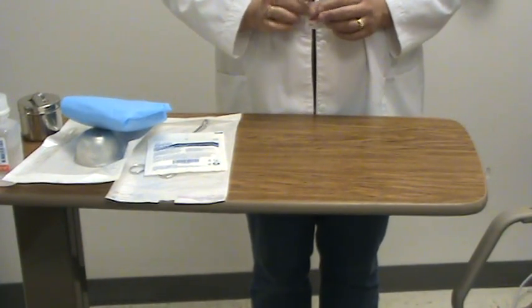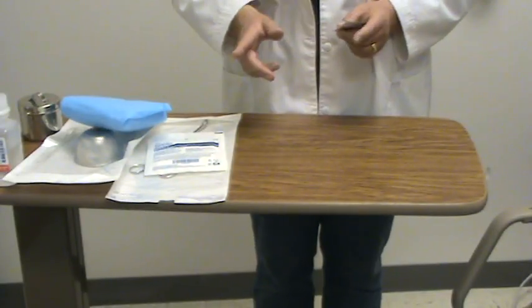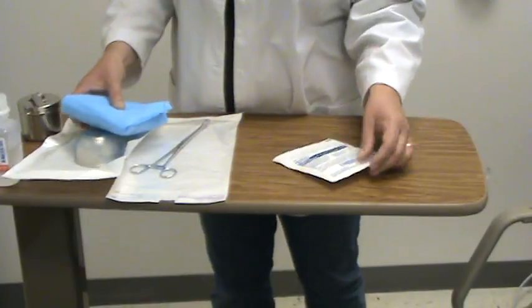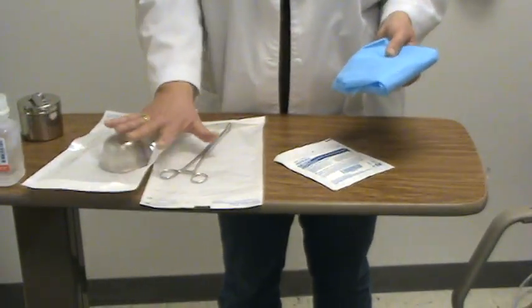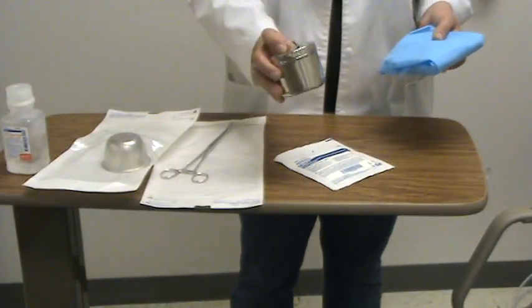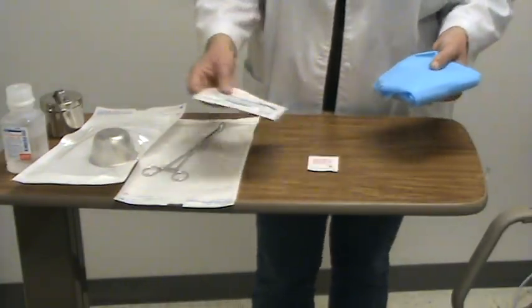Hi! The procedure that we're going to go over today is setting up a sterile field. I've gathered all my supplies: I need an alcohol wipe, a 4x4, my sterile package, forceps and a bowl that are in sterile containers, normal saline, and some extra 2x2s. This is the equipment that you're going to need for your video validation.